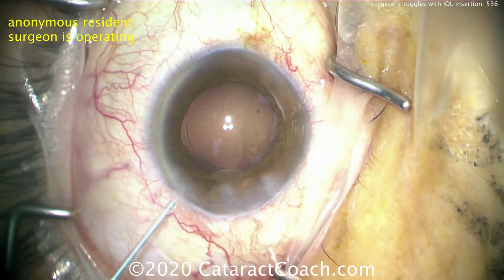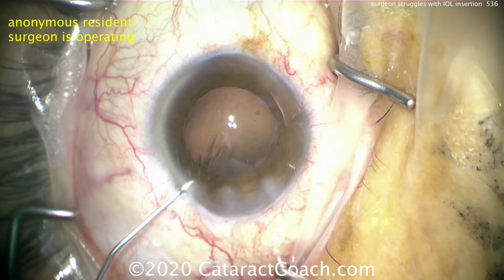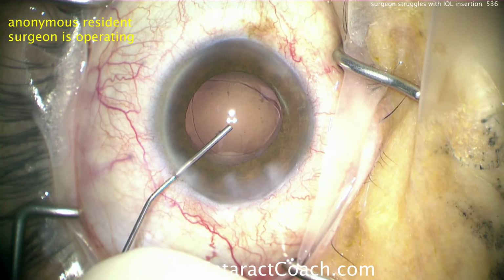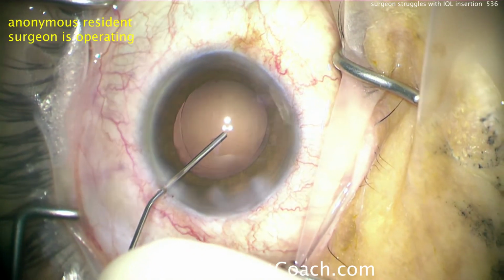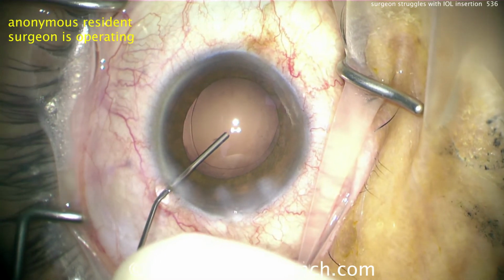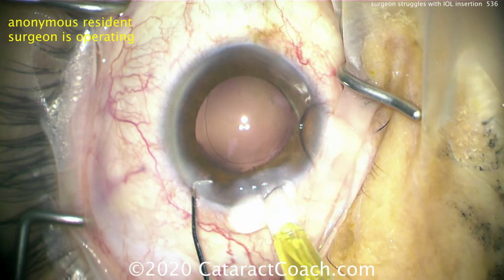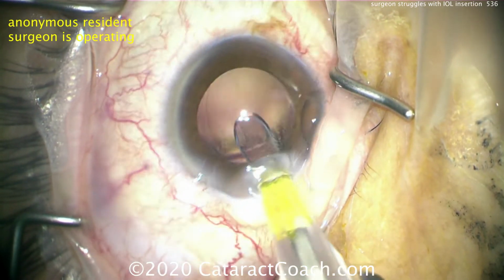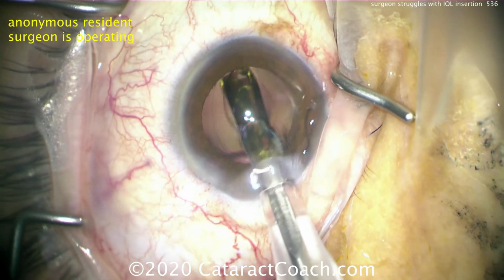So it's an anonymous resident who's operating, a completely normal case, good rhexis, time to fill the capsular bag with cohesive viscoelastic. Here it goes, nicely expanded, normal zonules, normal everything, totally routine case, looks great, good incisions, good rhexis. Here comes the IOL, a single piece acrylic lens. Lens power is 20. This is very much an average eye. Normal AC depth, normal axial length, normal everything.